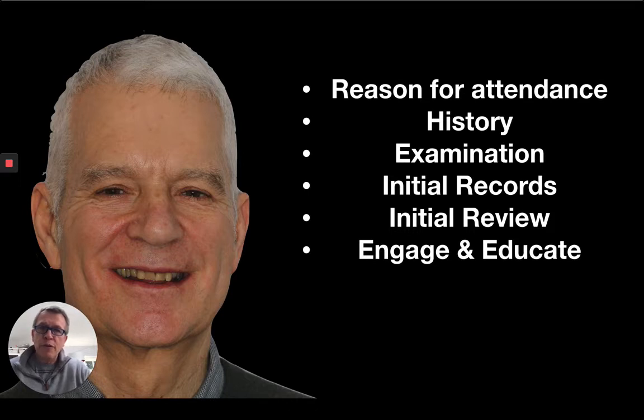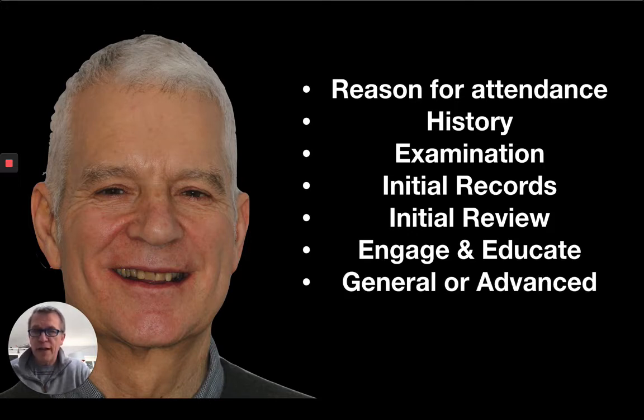So we're using them really to engage with the patient and to educate the patient, not over-educate the patient. But they've got to understand the things that we're looking at. So that's why we use the pictures and radiographs for that. And we're trying to work out, is this just a general biological patient, maybe the sort of patients that we're treating routinely, or is this what you might call a more advanced patient, a more challenging case, so that might require a little bit more thought?